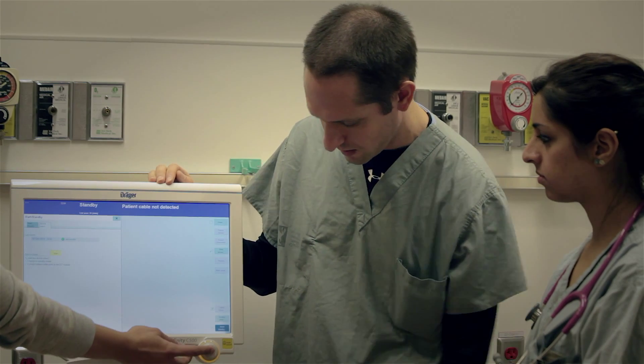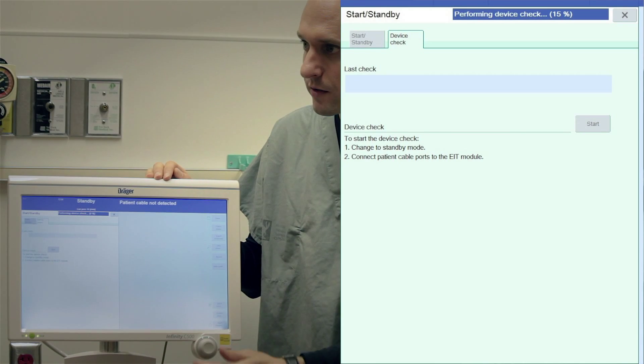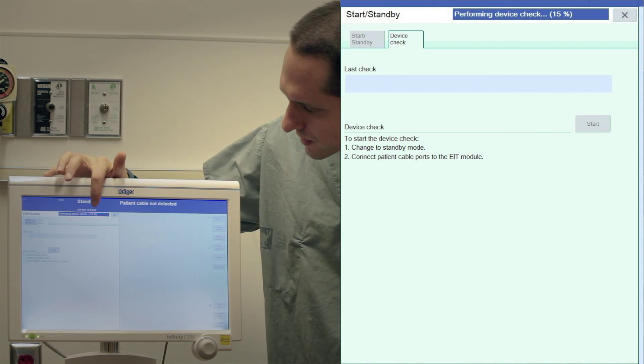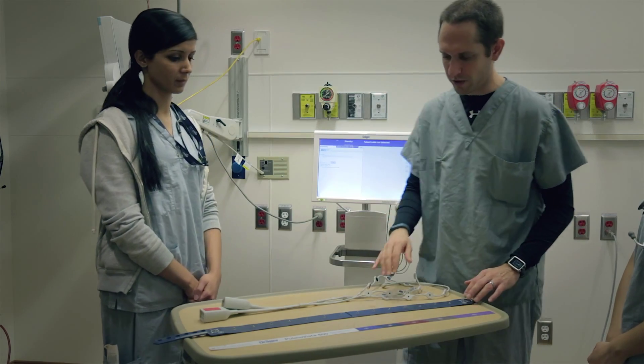Because the cable is plugged into the device, it will allow you to confirm. Anytime the circle is highlighted yellow, you need to confirm, and then this will take some time — it tells you what percent it's at. Now that we're waiting for the device check to complete, we're going to focus on the belt.